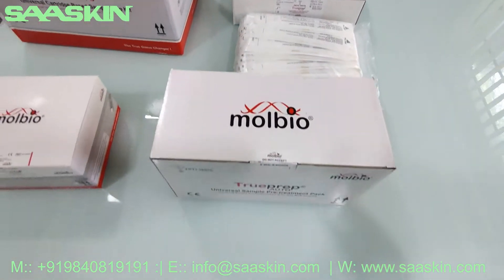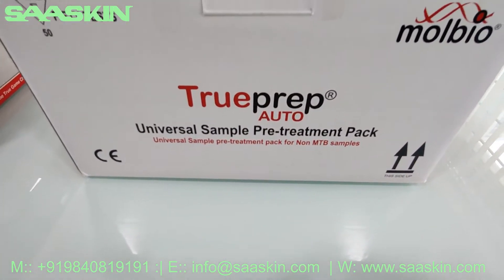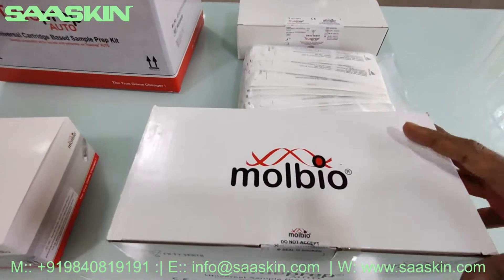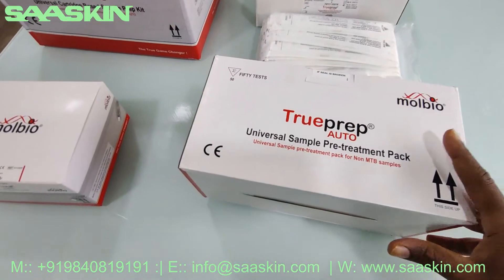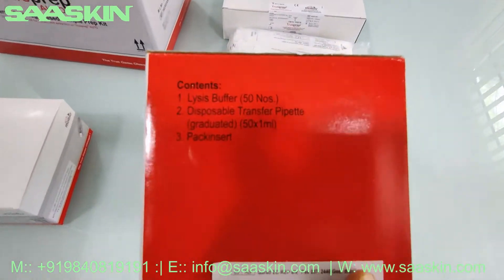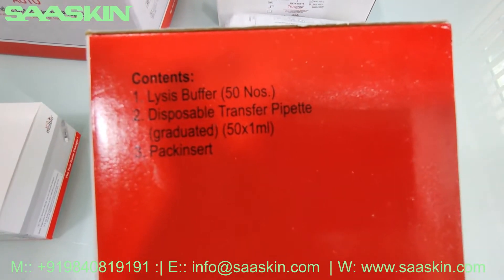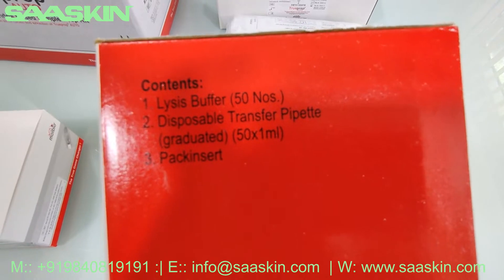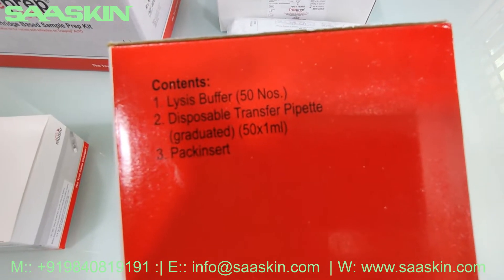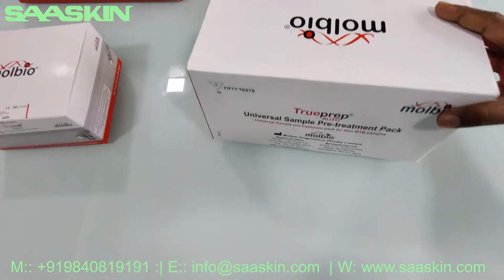Next I want to introduce you to the universal sample pre-treatment pack. This is how the box looks like — it is a CE-certified box. Let me tell you about the contents: this box contains lysis buffer, 50 numbers; disposable transfer pipette, 50, 1 ml type; and a pack insert. This is how the total box looks like.